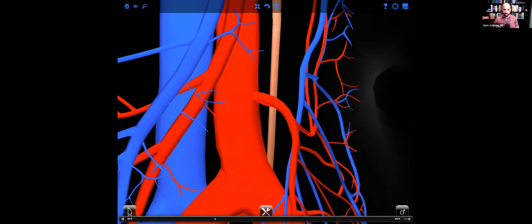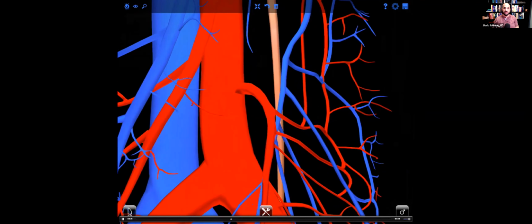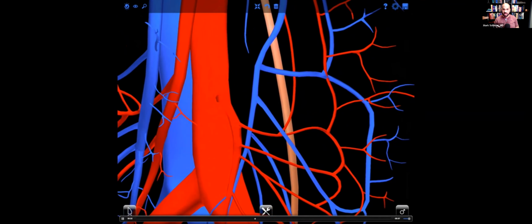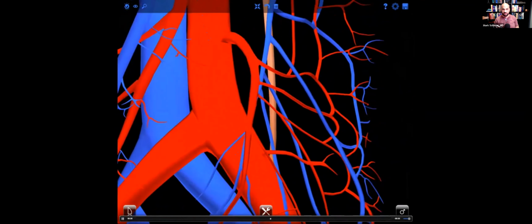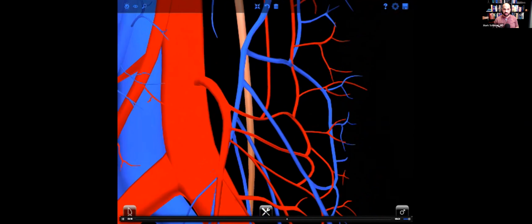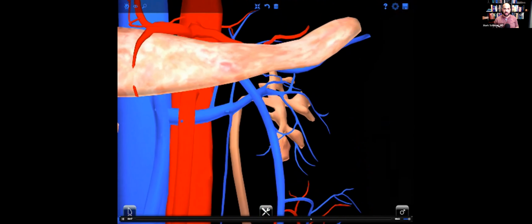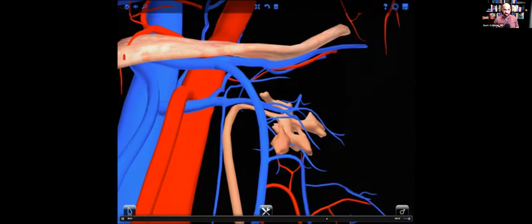And you can see what the anatomical relationships look like. You can see where the left ureter is. Left ureter runs deep to all this. I'll show some graphical representations of what this anatomy looks like. I'm just panning the image around here. Scrolling down, that's your superior hemorrhoidal, bifurcating. And we're going to come up, watch the vein. Vein, coming up, much larger caliber, dropping below the lower border of the pancreas, below the duodenojejunal junction, and right there inserting to the splenic vein.